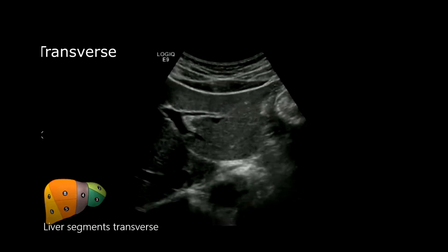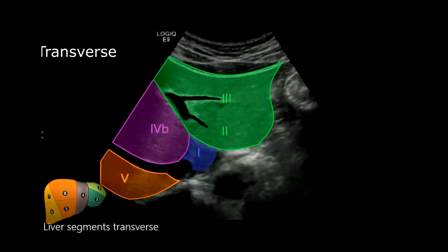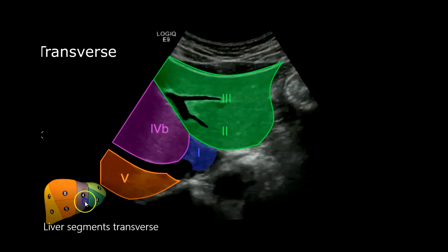Now angling from inferior to superior, you're going to have the portal vein branch feeding segment 3, the portal vein branch feeding segment 2, the caudate lobe (segment 1), segment 4b, and segment 5 — we're scanning right around this region angling upwards. Closer to the transverse face you're going to see the inferior segments: 3, 4b, and as you go more posteriorly, segments 2 and 5 as well as the caudate lobe.